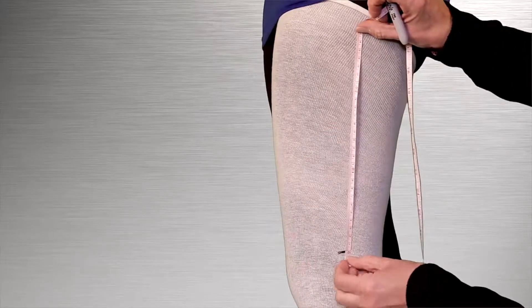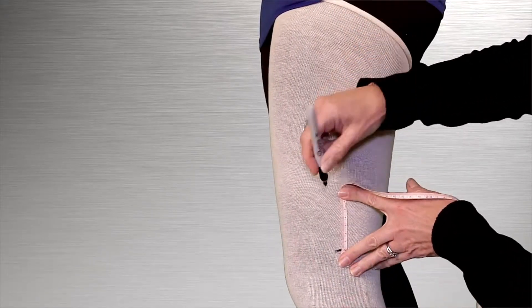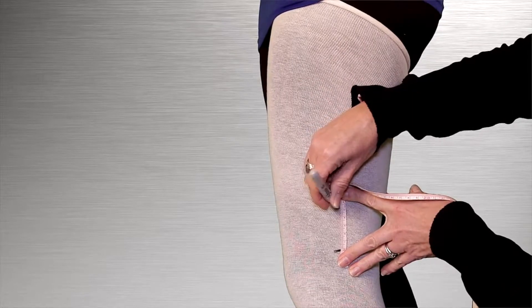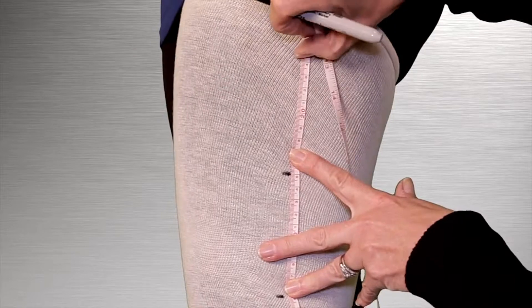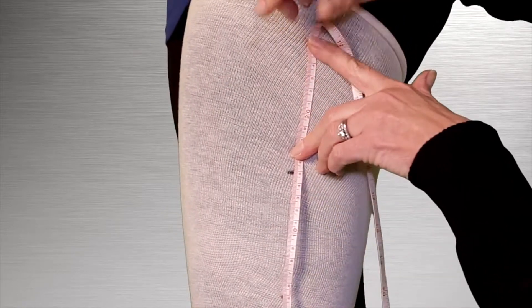Starting with the zero of the tape measure on the mark at the patella, mark the lateral aspect of the leg at 5 centimeters, 15 centimeters, and 23 centimeters above the zero point.